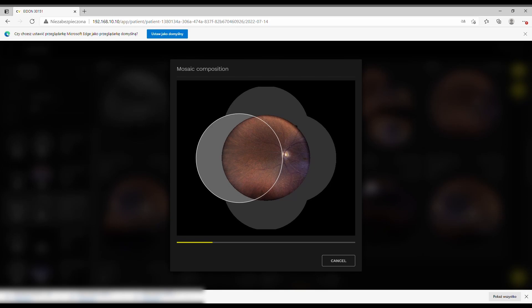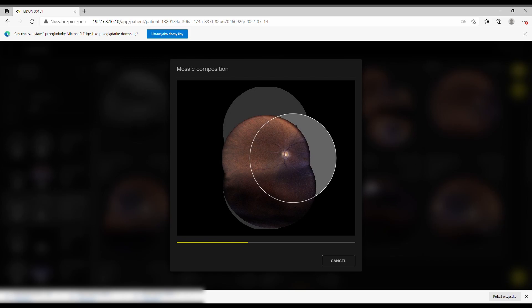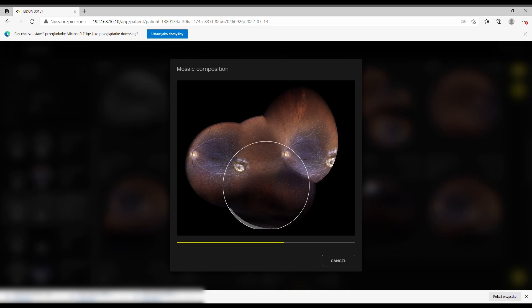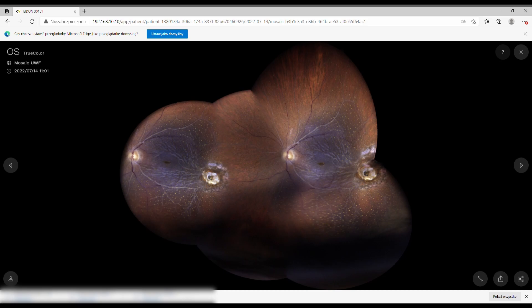Sometimes mosaics don't work correctly. I have a case to show — 99% of the time results are very good, but in a case like this TOXO scar, the algorithm mistakes the scar for the macula or optic nerve and gets distracted, creating incorrect stitching. So this is an example of the algorithm going wrong.